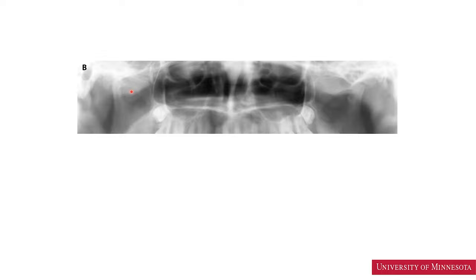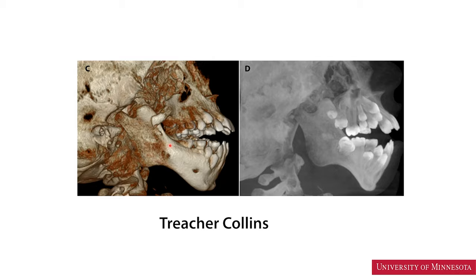This shows unilateral hypoplasia of the condylar head — this condyle is flattened and on this side we can see a much smaller condylar head representing hypoplasia. This is a Treacher Collins patient. In this patient, we see a hypoplastic condylar head. In addition, we can find hypoplastic zygomatic bone and zygomatic arch. In this patient, the zygomatic arch did not even form.